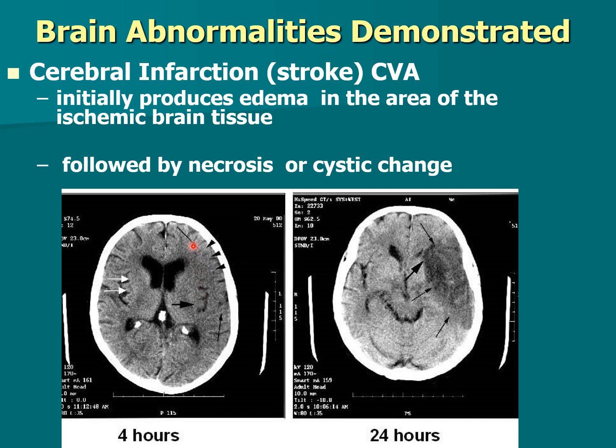But we're proving here that they didn't have a bleed, and then we did this to start with. They didn't have a bleed, so then we may follow it up with a contrast study, a CVA, but we still see our calcified pineal glands, and we see calcification here in the choroid plexus of the lateral ventricles, which is totally normal.